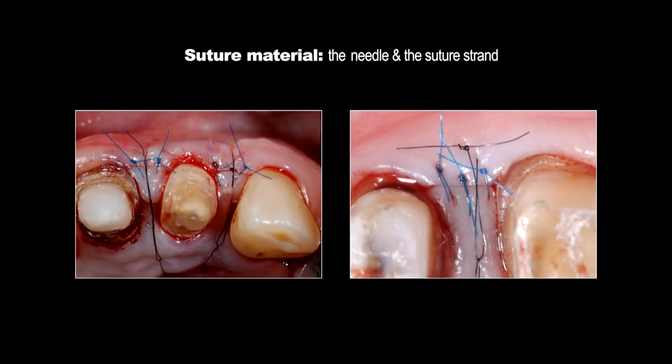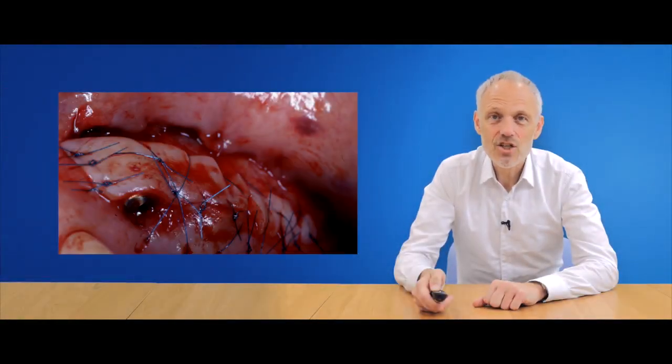On this slide you see a suture papilla, and you can imagine that a tissue with a diameter within millimeters should not be sutured with suture diameters of 3/0 and 4/0. Otherwise the mechanical trauma will be too high, and additionally, as we already have seen, the tension of a suture of 3/0 and 4/0 cannot be controlled by the surgeon. In the following section we will talk about suture techniques.